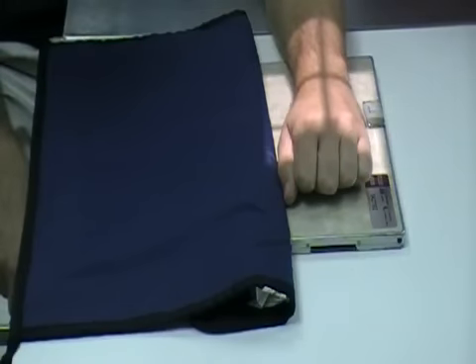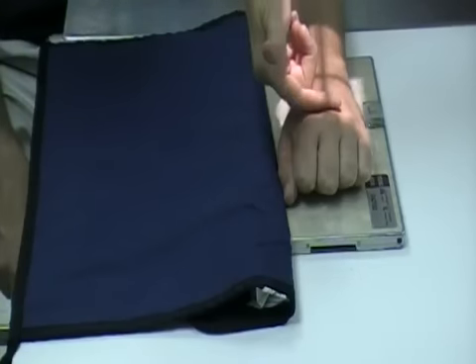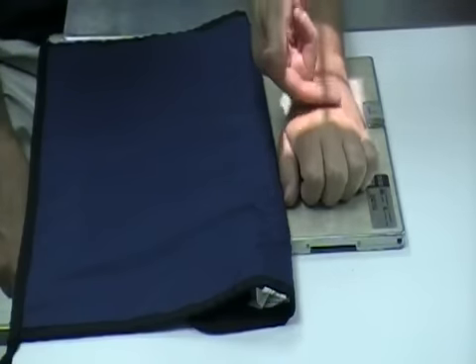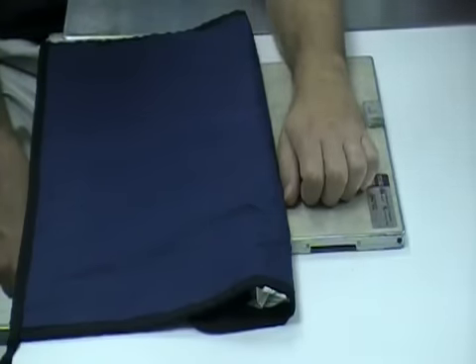For the wrist x-ray, we'll be doing the PA, oblique, and lateral. This can be accomplished three on one — collimate tight on the sides. You do want to get either most of the metacarpals or almost half, because the radiologist usually likes to see well beyond the actual carpal bones, as well as the distal forearm.